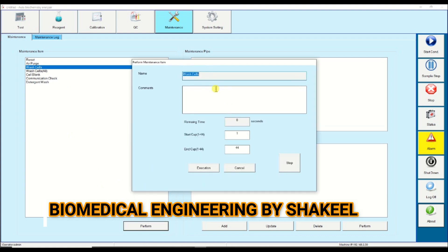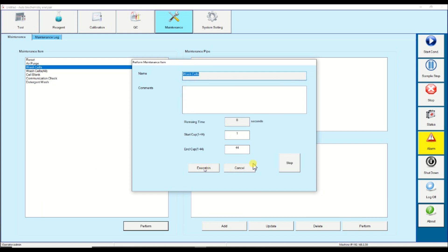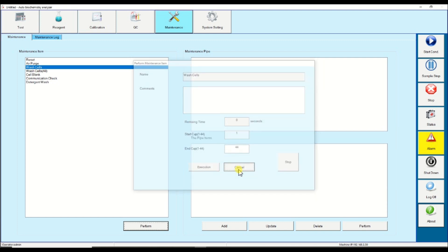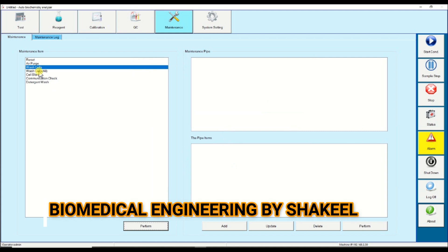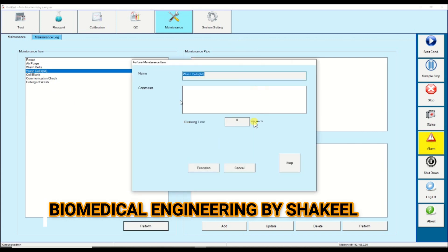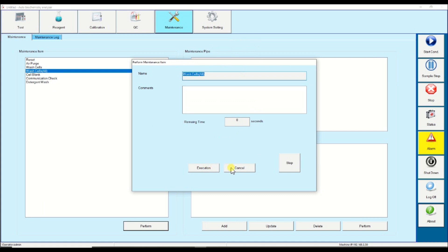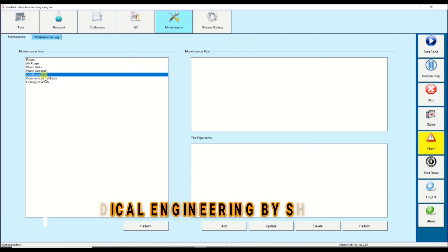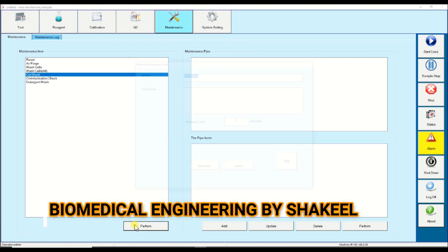Once you click on wash cell and click perform, the total cuvettes are 44. If you want to clean the cuvettes as per your choice, you have to enter the starting cup and the ending cup and then click on execution. In this way you can do the washing of selected cuvettes. The wash cell option will clean all cuvettes from 1 up to 44.